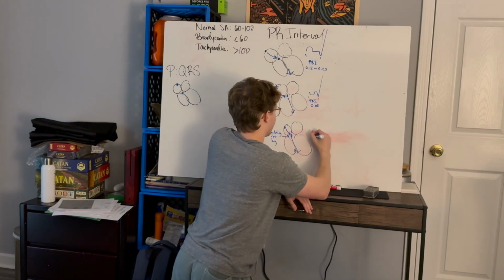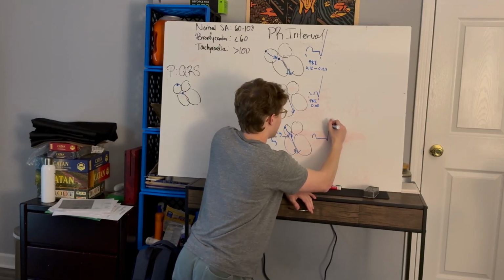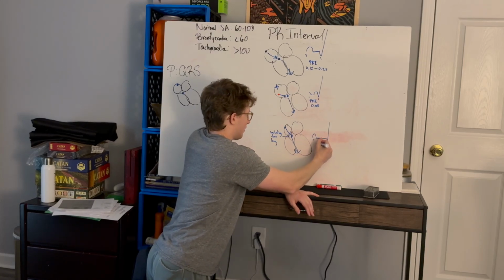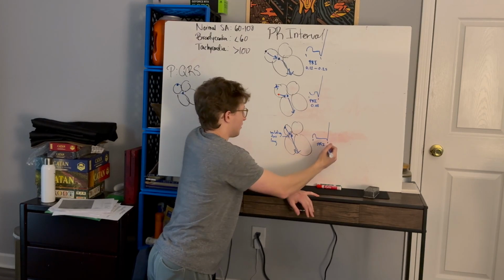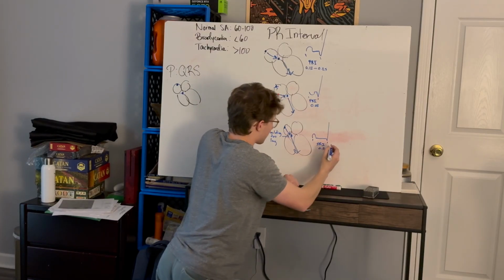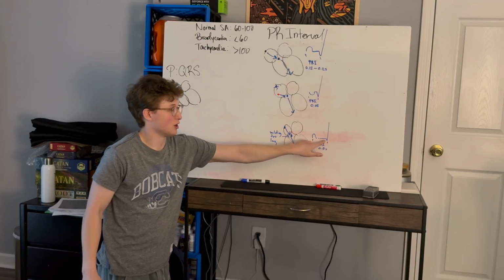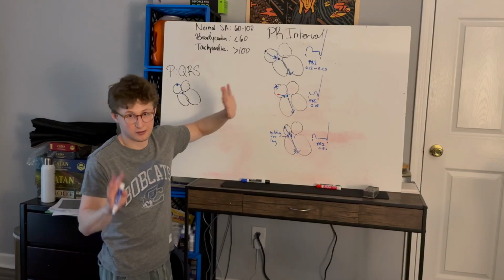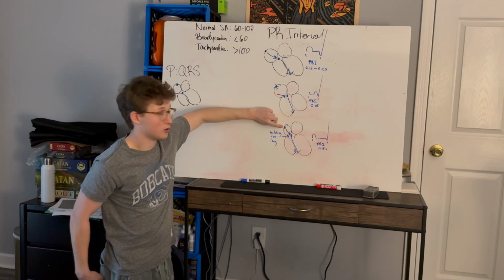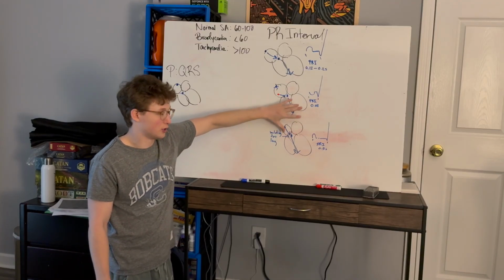And so what you might see. So in this case, you'll see lengthening of the PR interval, because in first degree AV block, when the SA node fires normally, it goes through both atria normally.